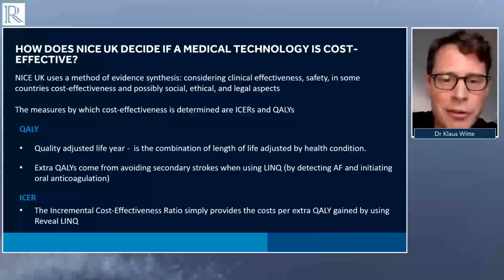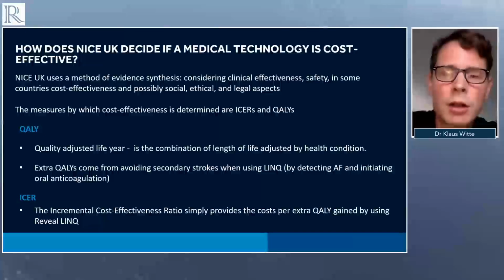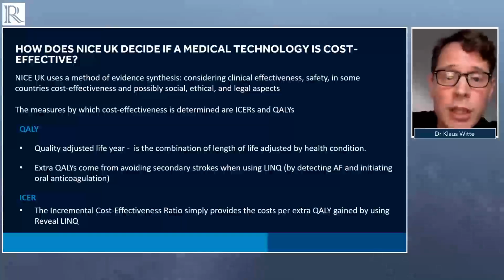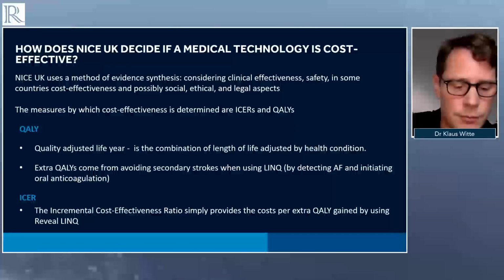And as Matt has hinted, almost nothing is less expensive as we go forward. Almost everything is more expensive. But how much more expensive and how much more quality of life do we get? You might only get 6 months of full quality of life, but if you can put that into the calculation, you can figure out the incremental cost effectiveness ratio.